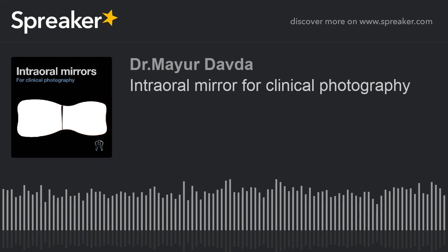Why do we have to use intraoral mirrors for photography? The answer to that is extremely simple. If we want good pictures, we need to try and be as frontal or as perpendicular to our subject as possible. Now, with the limited space that's available inside the patient's mouth, it's difficult to get that kind of angulation. So, the only way out is to use an intraoral mirror for documentation purposes.